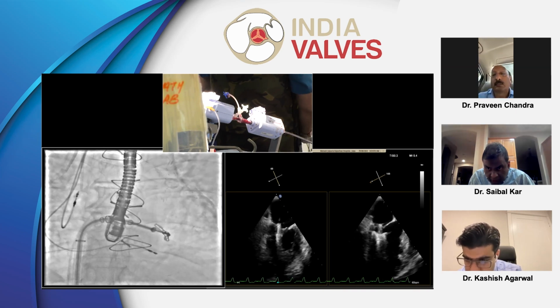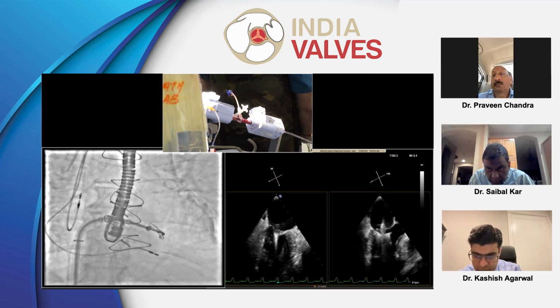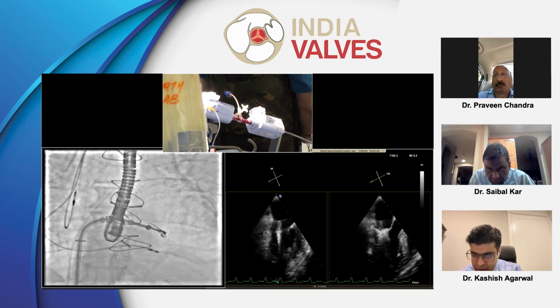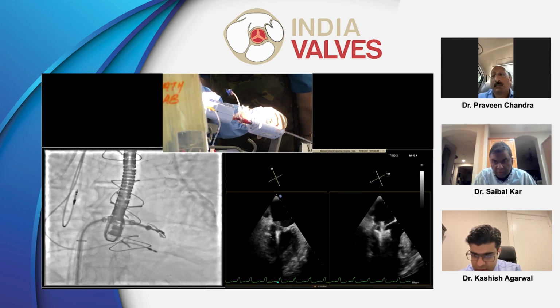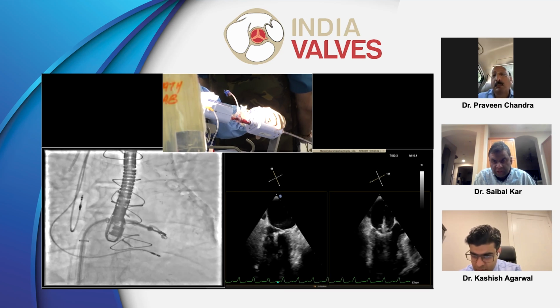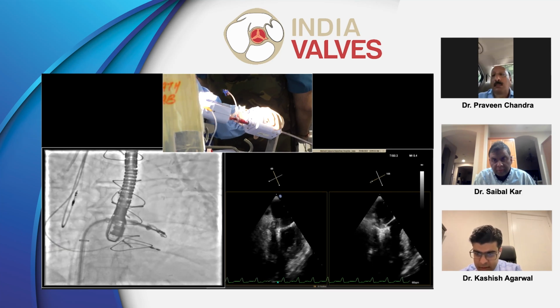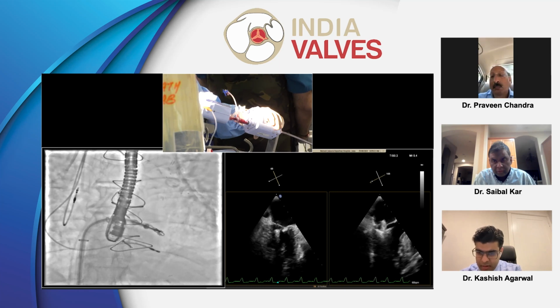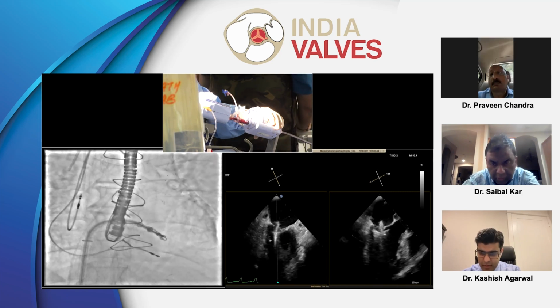Do you think it's pinning? I wonder whether it's stuck on the mandrel. Or is it pinning, or are we not in the right spot? Either of them could be true. You see the anterior leaflet coming down, but you don't see the flail going up. I don't think it's the right spot. It's just medial to it, so I'm going to go lateral. Pull back. Yeah, but he's correct. Where the hell is the flail? Probably it might not be going to the LA because the clip might be holding it to the LV side. No. 3D and fast, please, Prashant. Let's just see where we are.